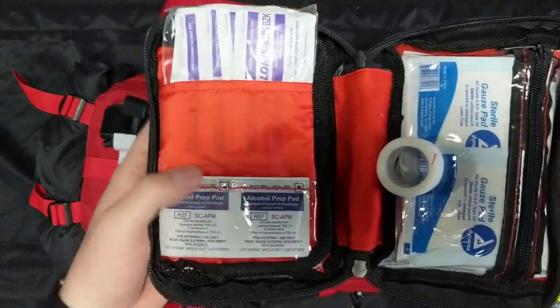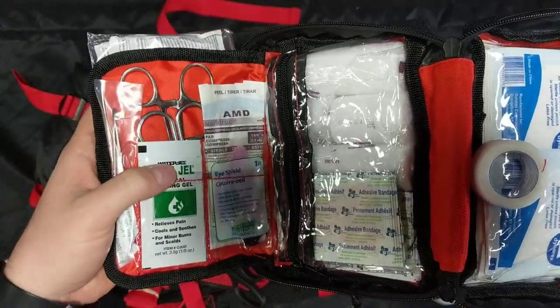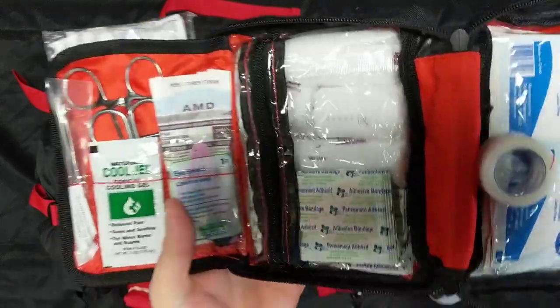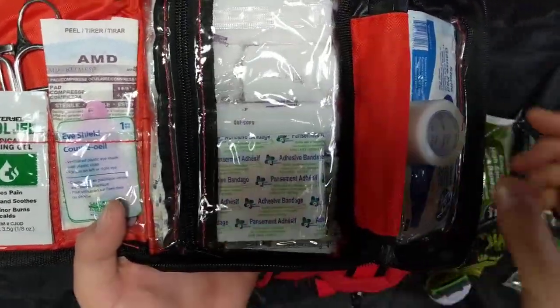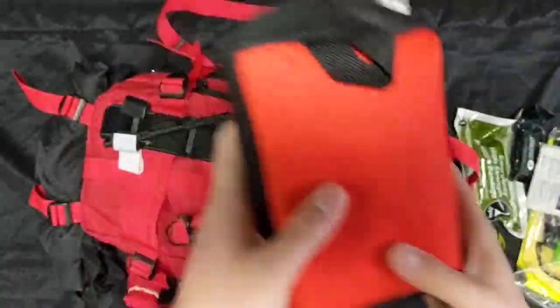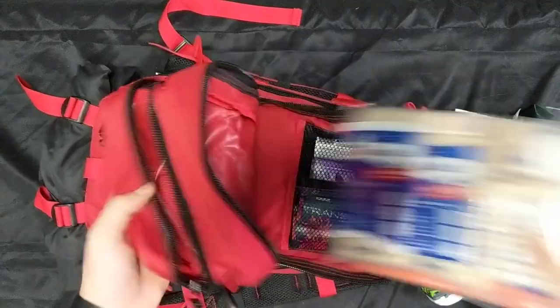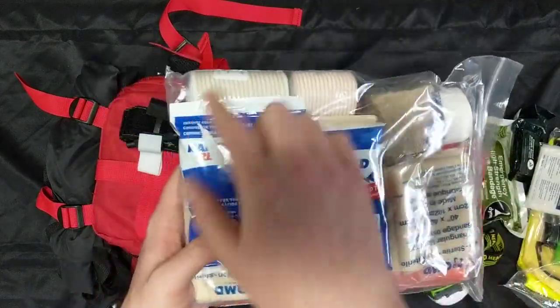The wound kit has all your wound care items: alcohol and BZK wipes, Kelly scissors, tweezers, burn gel, eye pads, and an eye shield. You also have all your cling or roller gauze, bandages, tape, and a bunch of different types of gauze — all nicely encased.